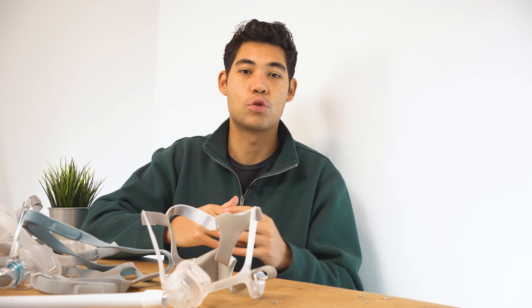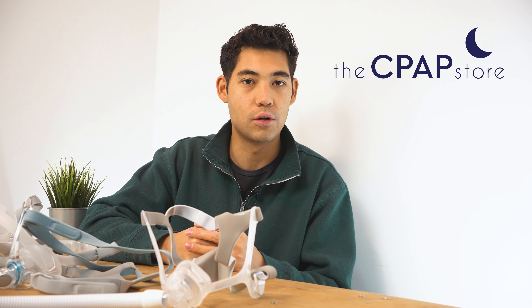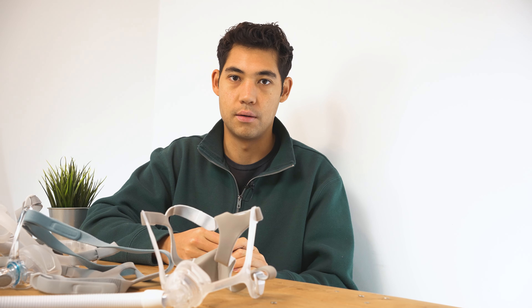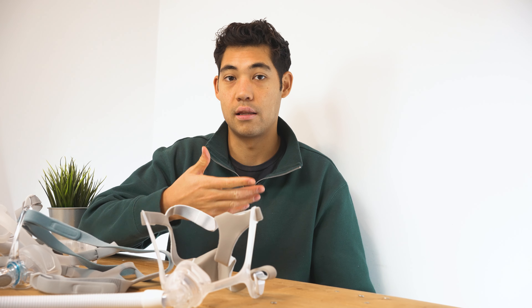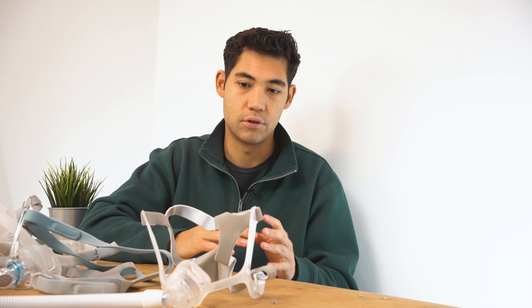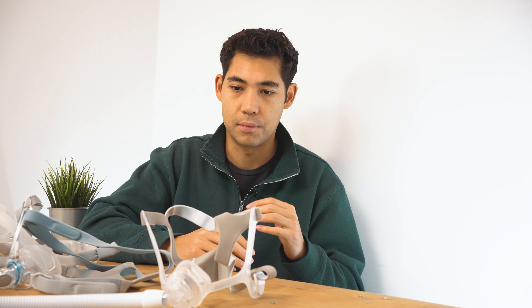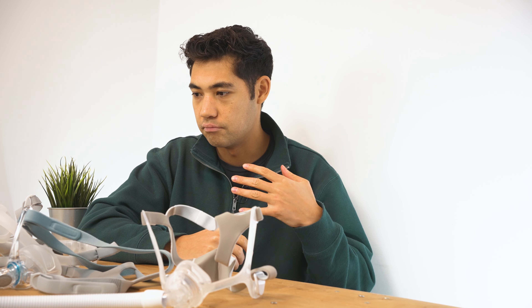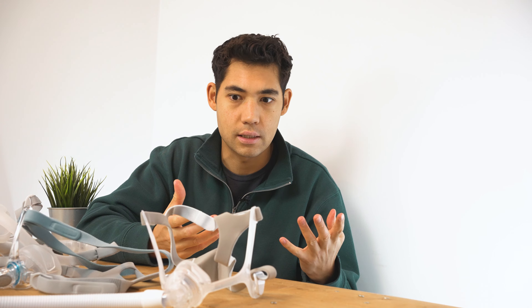Hi everyone, my name is Tristan from cpapstore.ca and the CPAP Store YouTube channel. Today we're going to be looking at my top nasal masks. We're going to look at three categories: on-nose nasal masks, below-nose cradle, and pillow. Those are the three categories and I'll be talking about my favorites and why.